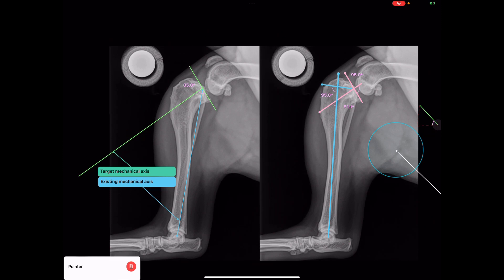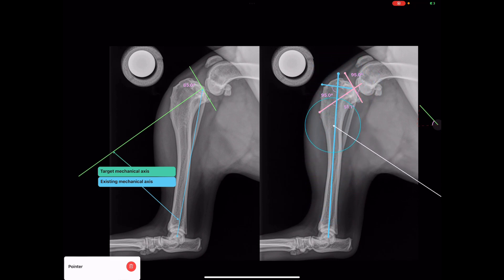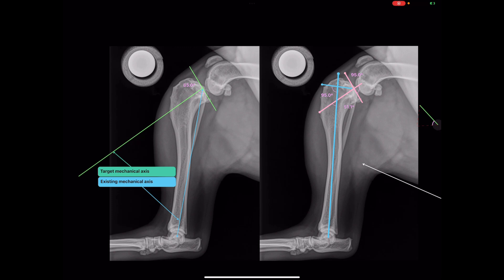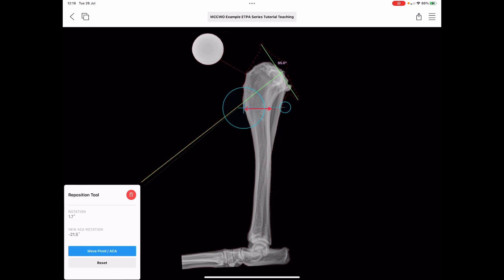Schematically, we're going to be aligning a proximal bone axis with our distal blue axis, aligning our target with our existing axis. To visualize the steps and understand the planning, we define the transverse osteotomy level at the distal end of the tibial tuberosity.